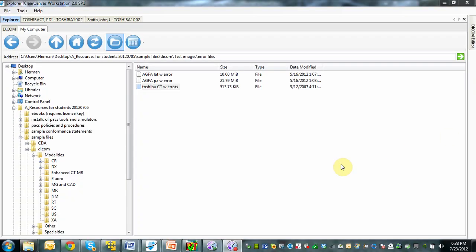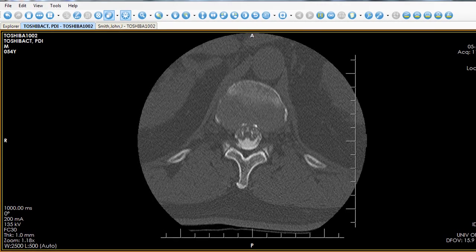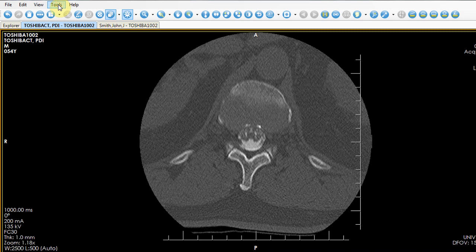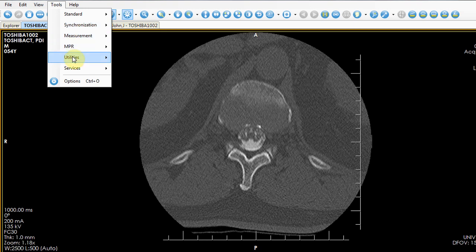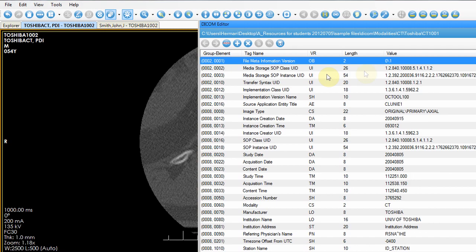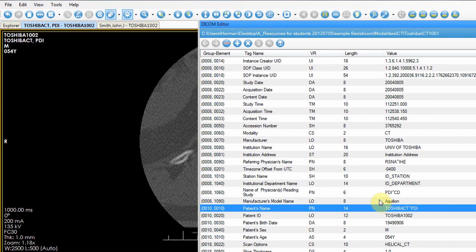When you have installed ClearCanvas, you will see this particular screen. It basically has two tabs: an Explorer tab, which allows you to browse your computer and pick a particular file to bring up. If you bring up a file — this is a normal CT image — you can look at the information in the header. The tool we use for inspection is under Tools, Utilities, and there is a button called DICOM Editor. If you click on DICOM Editor, you'll see all the information in the header. For example, the patient name on tag 10, 10 will be Toshiba CT PDI, the patient sex will be male, and so on.